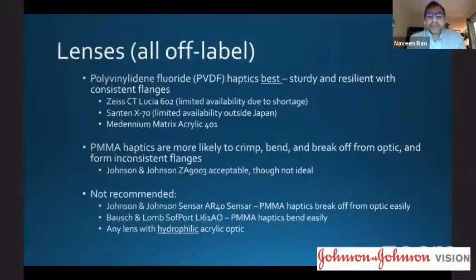PMMA haptics are much more likely to crimp, bend, and break off from the optic, and they form inconsistent flanges. I've used the Johnson & Johnson ZA9003 lens, and I know some colleagues internationally have used that extensively. It's not ideal, in my opinion. It's not as strong as the PVDF haptics, but it can be used. I would not recommend using the AR40 or the LI61AO lens for this type of procedure because those haptics break off much more easily from the optic, and they bend easily. They're fine lenses in general, just for this purpose, they're not as good.